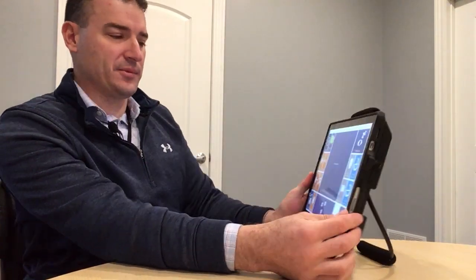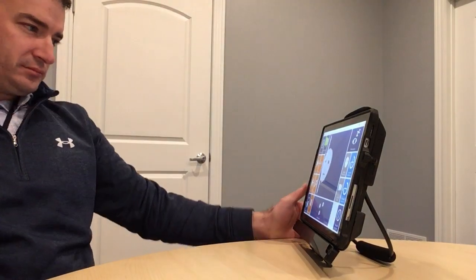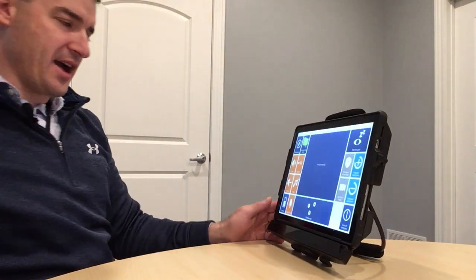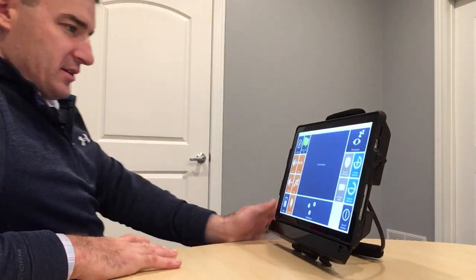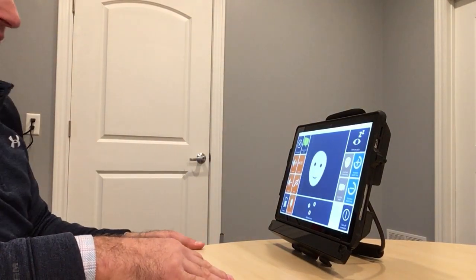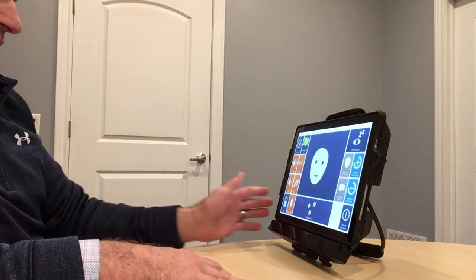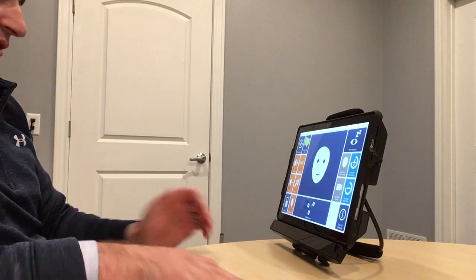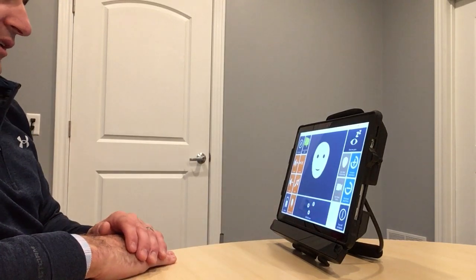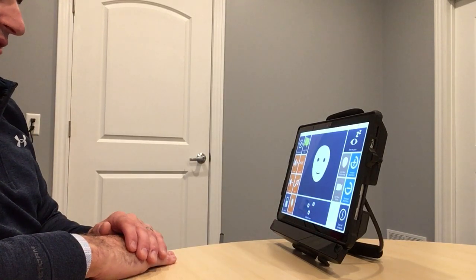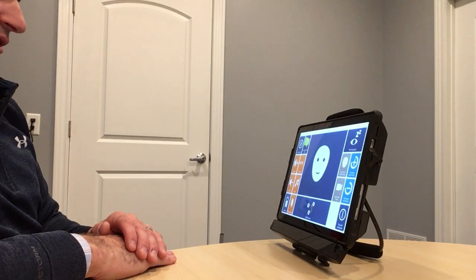One of the nice things is with our new WinSlate, our flexible handle and stand is longer so I can eye track in any position. I can eye track on the tabletop — I don't need a mount. So I'm going to come over here and use this position guide. You can see the avatar — when he's smiling and clear and white, that means he's in the right position.